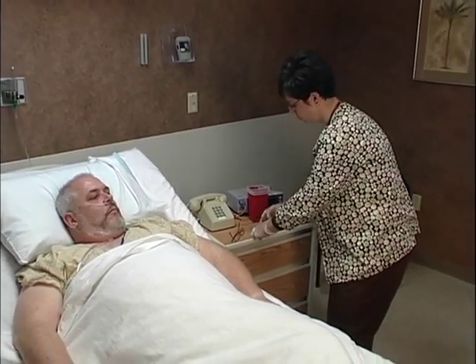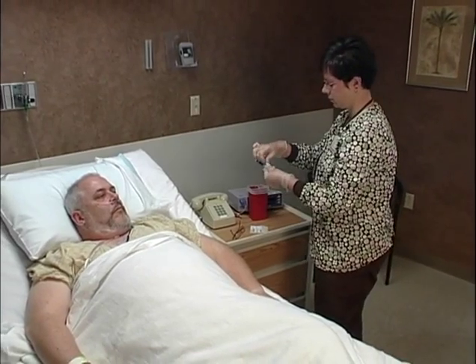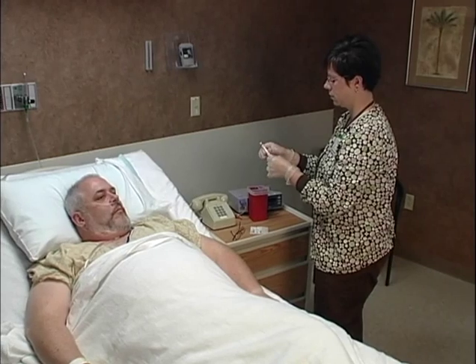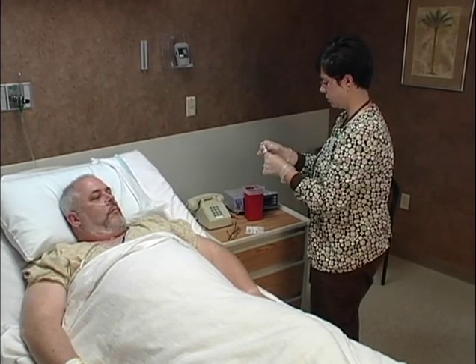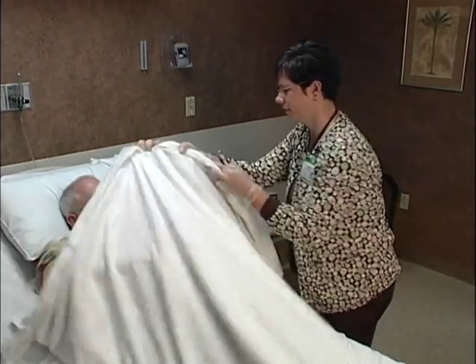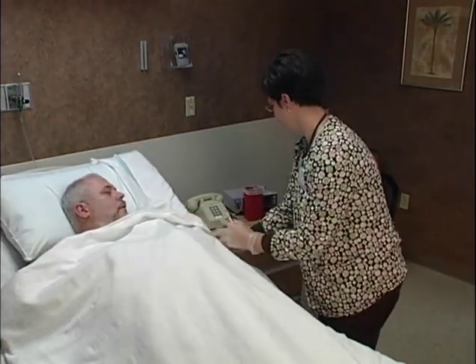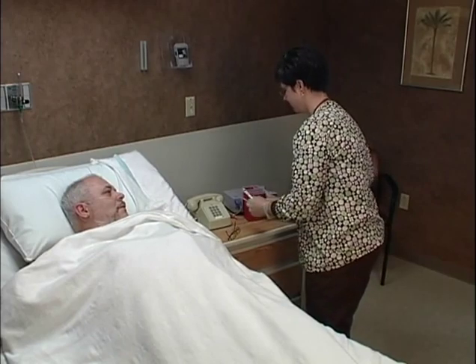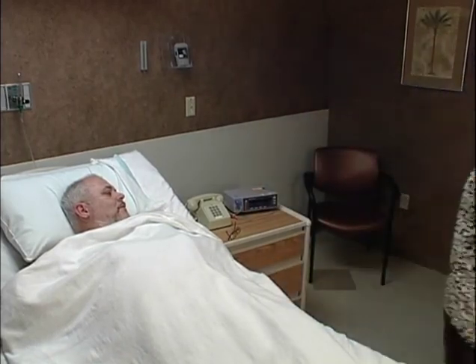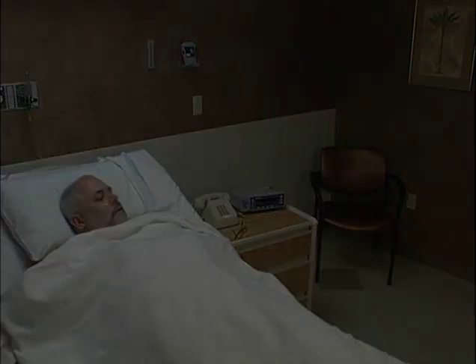Before leaving an inpatient or dismissing an outpatient, label the specimen according to facility policy. Specimens collected in plastic syringes should be transported to the testing facility at room temperature, preferably within 15 minutes, but no later than 30. Do not transport specimens drawn into plastic syringes on ice.